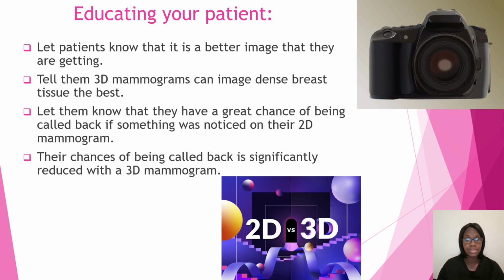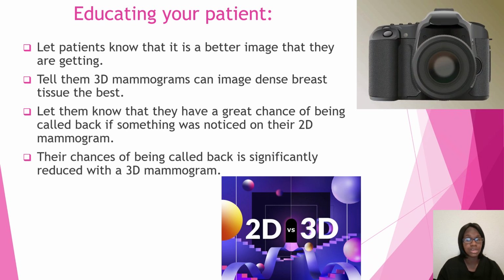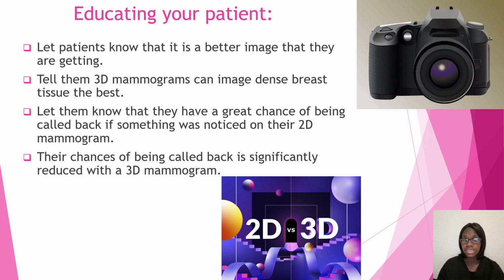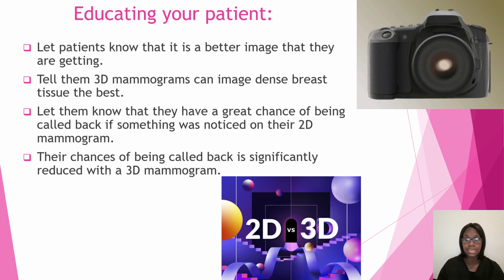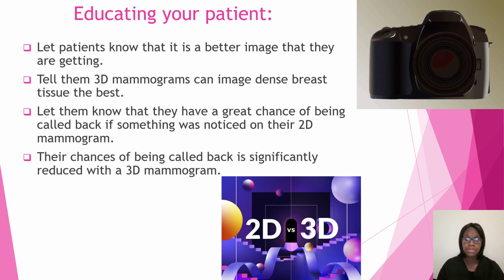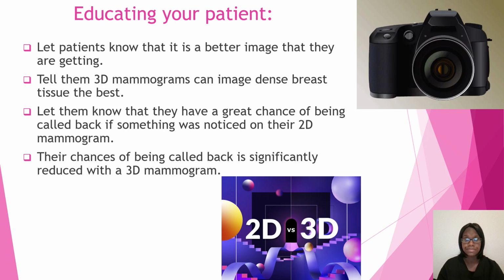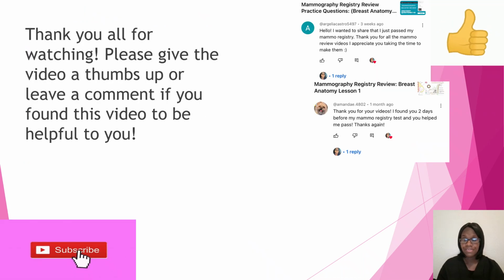Most of the time when I do, they say, yeah, I'll go ahead and get it done, whichever one is the best. You can also tell them it decreases their chances of being called back if they get a 3D mammogram, especially if they have dense breast tissue. The 3D is best.